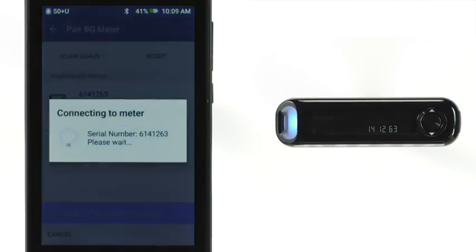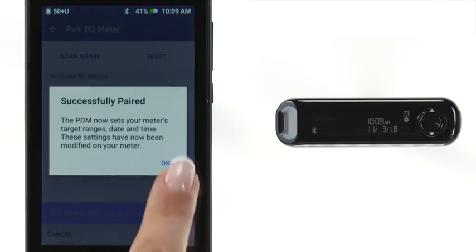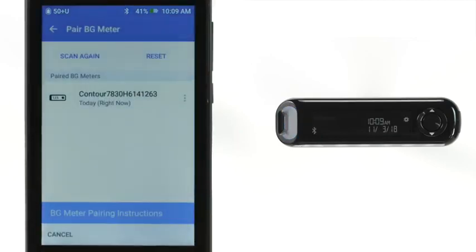A successfully paired message will appear on the PDM. Tap OK to verify that your meter is paired. You can optionally rename your BG Meter after pairing it.